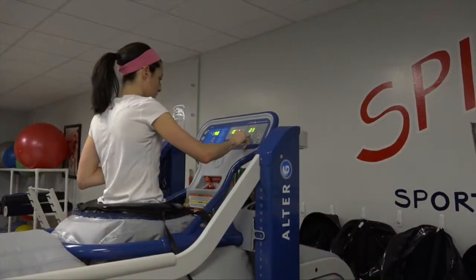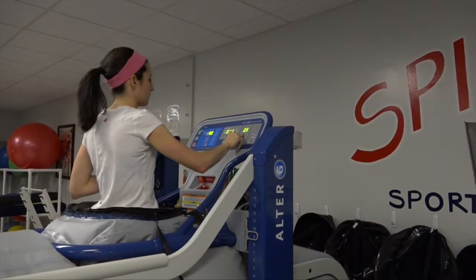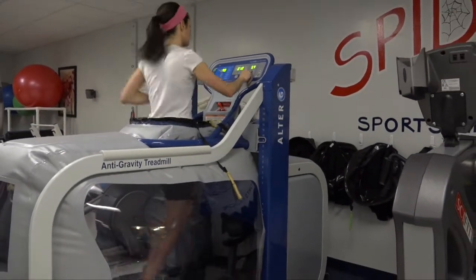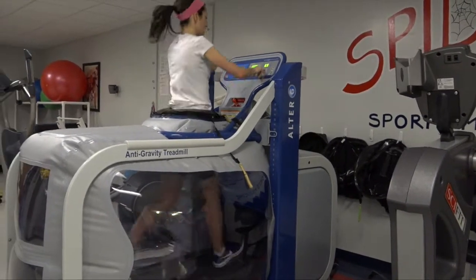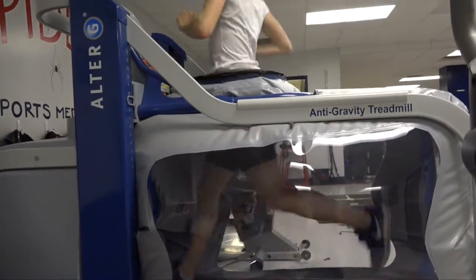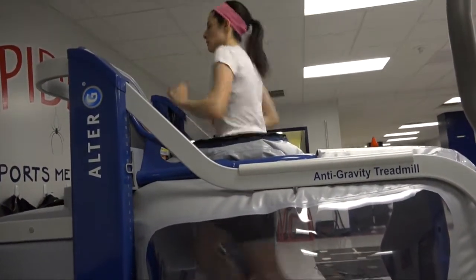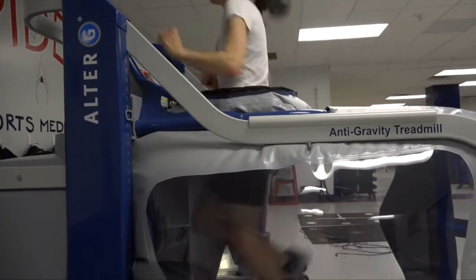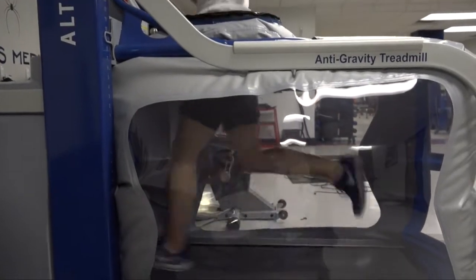Specifically for our program, we are runners — that's what we do, that's how we train. When we can't run, it really has a tremendous impact on the ability to get in the fitness that we want our athletes to be in, because they're not running. We can cross-train, get in the pool, do a lot of other things, but we run, and that's what we need to do.